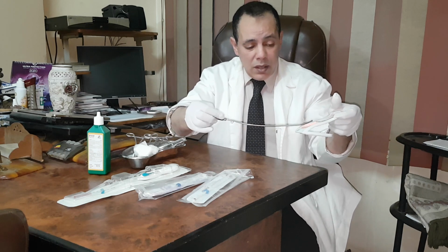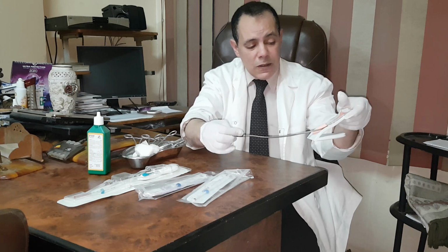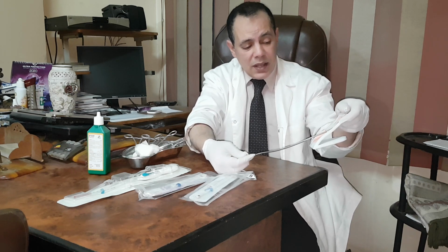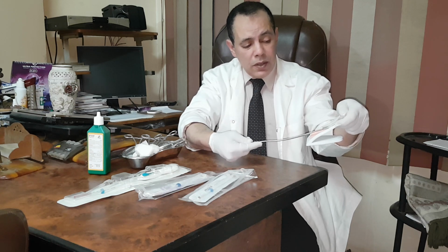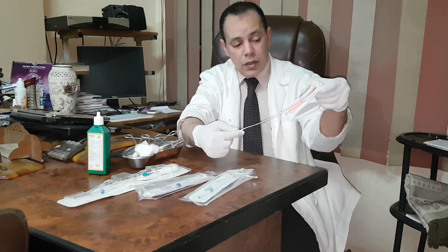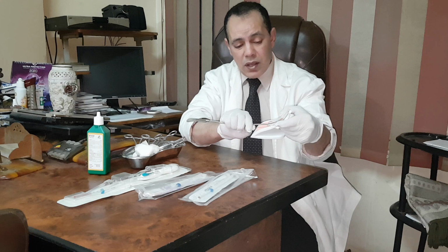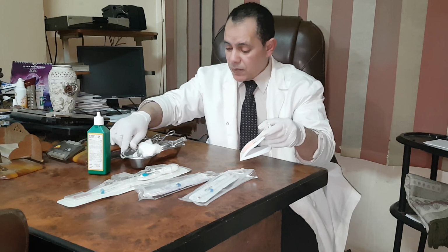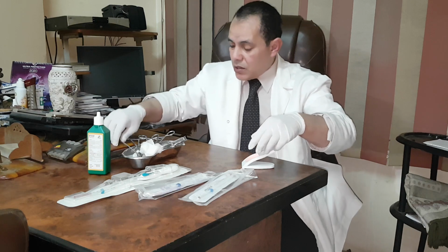When you insert the sound, you will find two resistances. The first resistance is the internal os. The second resistance is the fundus of the uterus. So try not to be rough, so as not to injure the uterus or cause perforation. So two resistances will meet you. The first one is with the internal os, the second one with the fundus. Then I know now the length of the uterus.